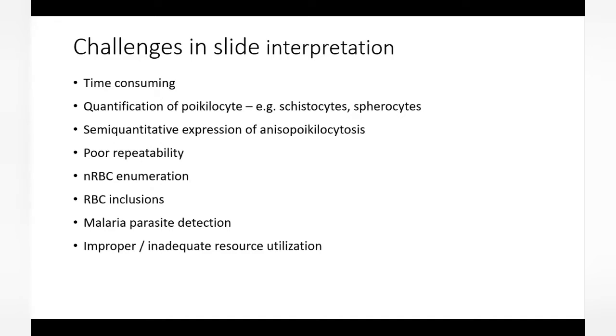And so your mind is sort of not always ready to capture the intricate and maybe subtle clues that there are on the smear. I mean, a good pathologist, and I think you'd all agree, has to review all the cells and look at the background, look at the entire slide, do a proper differential count, correlate it with the graph and the values that the cell counter has provided.